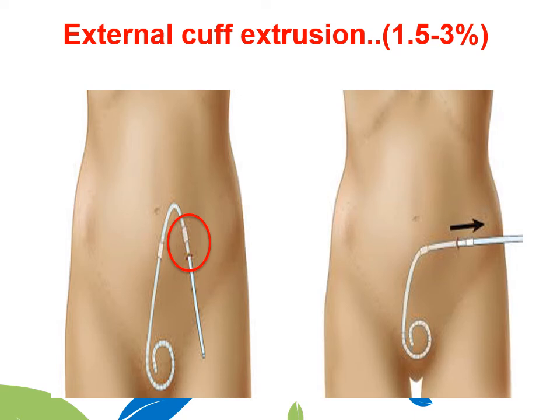You can just shave it off with a scalpel, take it off the catheter, and be very careful not to make any cracks or any pins in the catheter, and keep the catheter as a single cuffed catheter, no problem. And later on you can change the catheter, but there is no emergency in dealing with that issue.